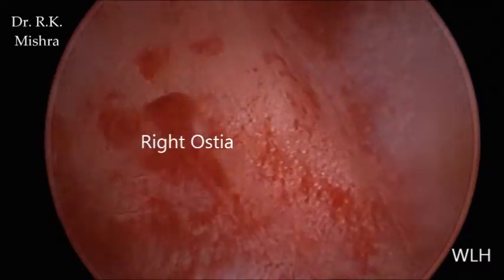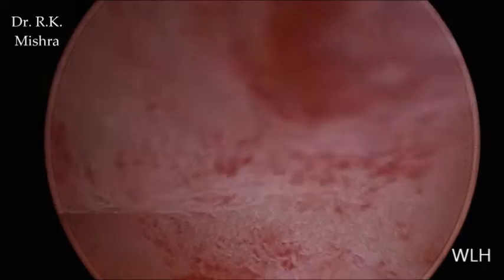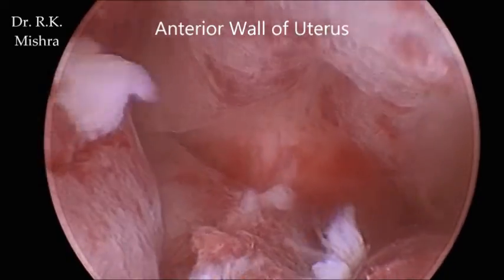This is the right ostia, and now slowly the cavity is collapsed as the hysteroscope will be pulled out. Thank you very much.